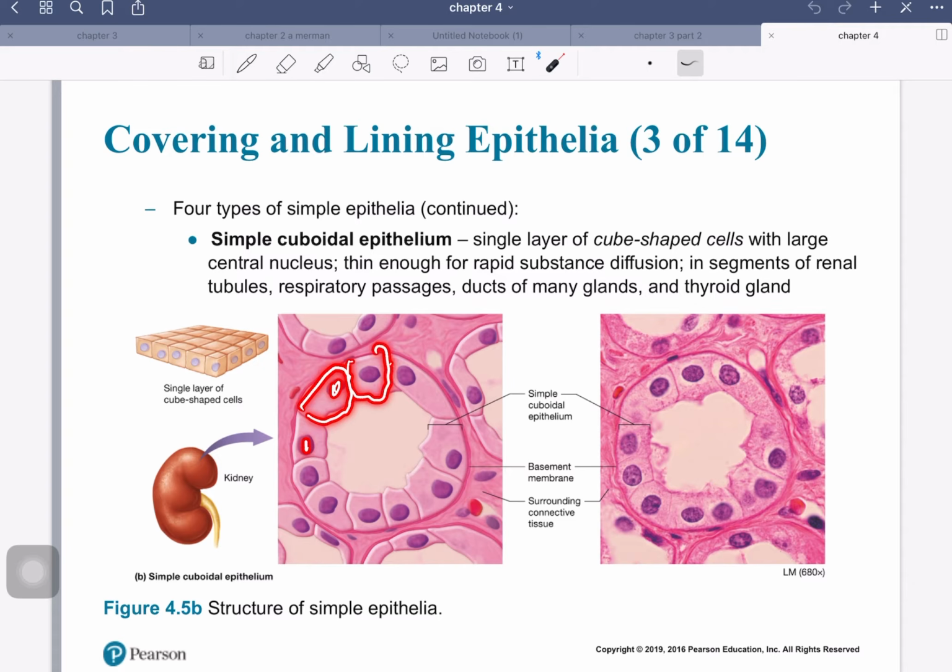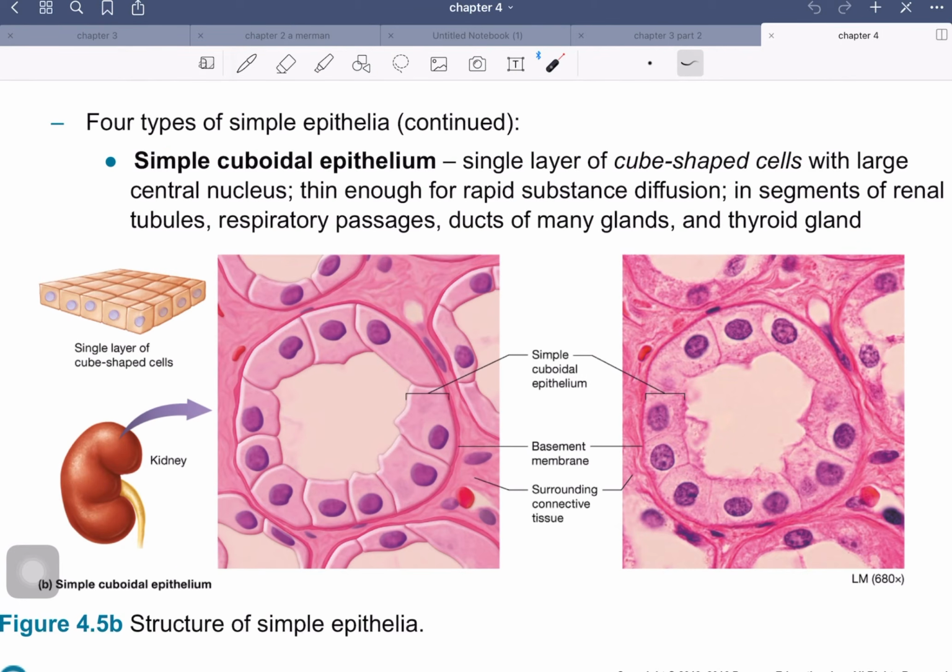There's the epithelial cells. Right, various epithelial cells. Now, this is called simple cuboidal. So it is one cell layer thick, and you may look in and go, well, this doesn't look exactly like a cube, but it sort of kind of does. So it's cuboidal. Right? Now, we can see the same theme. Here's epithelium, and here is a thin layer of basement membrane underneath, and here is connective tissue. That's down here. They go hand in hand. They're like best friends forever in the world of histology, largely.